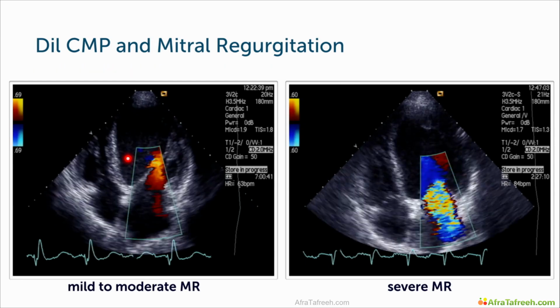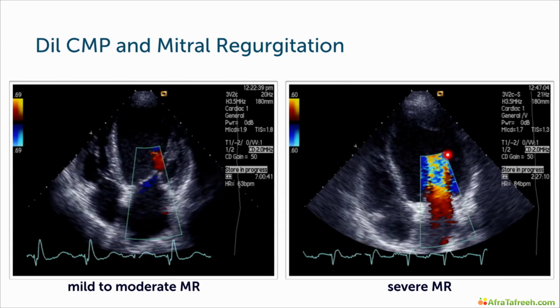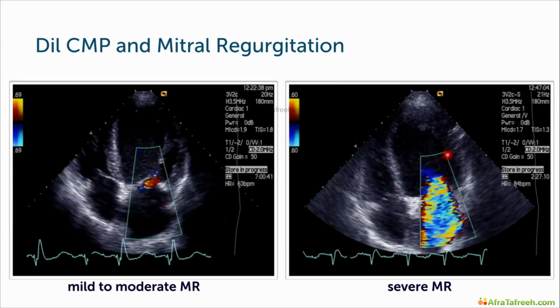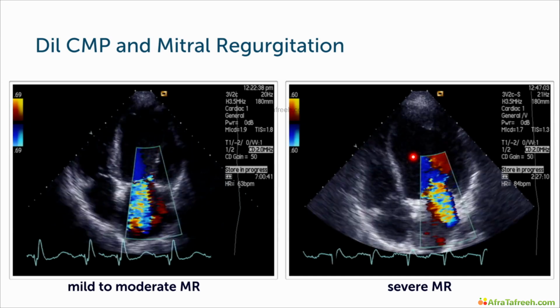This is probably not the case in this patient. So not only does this patient have a worse left ventricular function to start out with, but he also has volume overload. So this is the patient who probably has a much worse prognosis and probably also more symptoms.